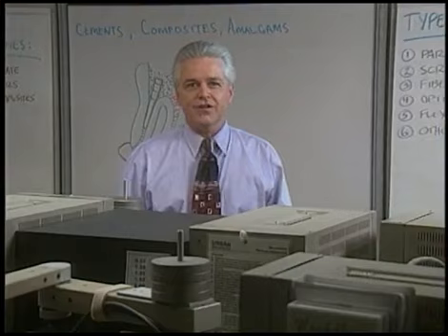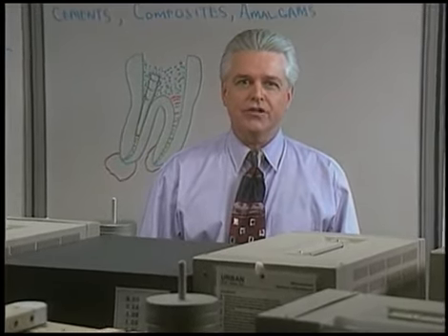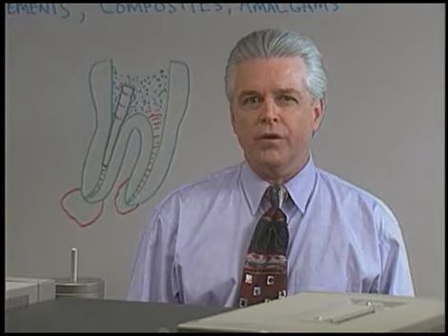Recently, there's been a renaissance in our approach to endodontic retreatment. The great news is we can generally, non-surgically remove post and broken instruments with today's technology. Hi, welcome to Ruddle on Retreatment. Today we're going to focus on the non-surgical removal of post and, a little later, broken instruments.